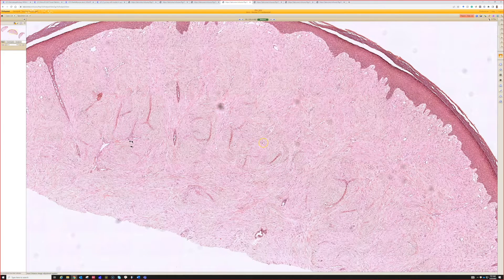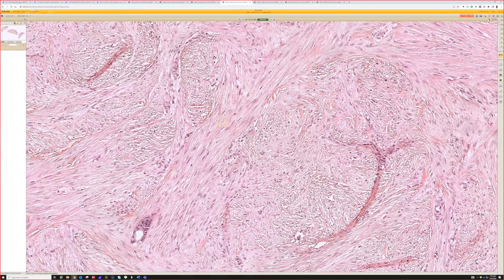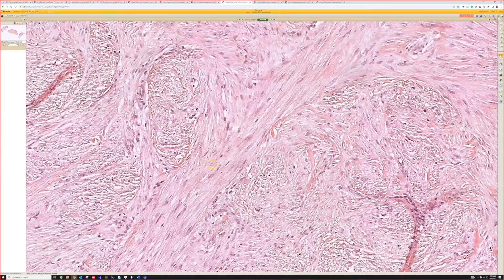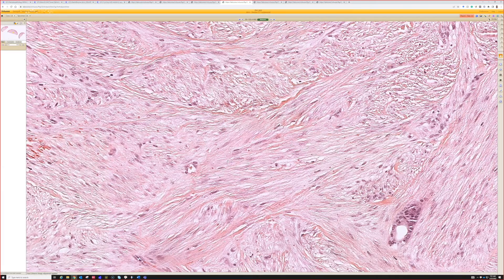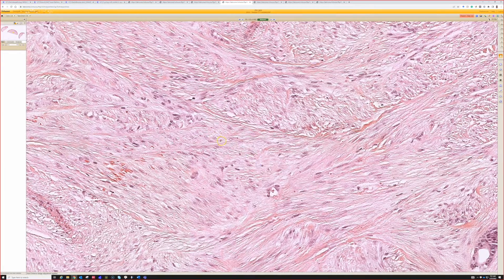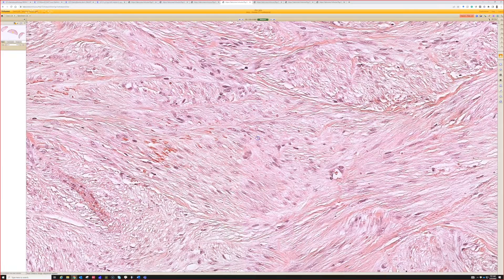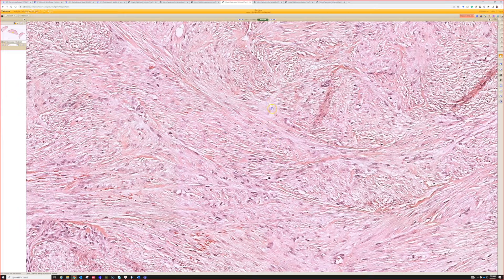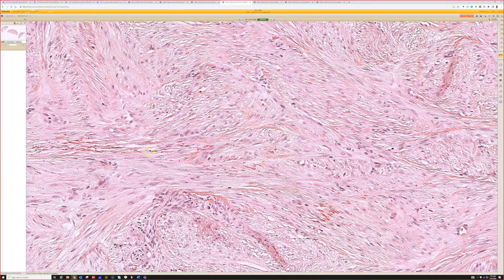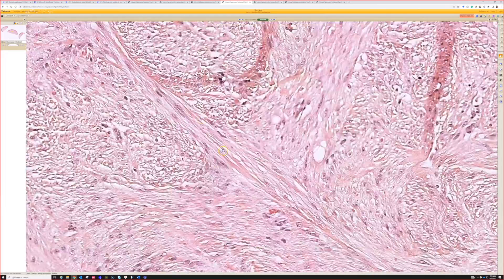It can sometimes extend down into the subcutis but usually fills up the dermis, with somewhat intersecting fascicles of bland fibroblasts or myofibroblasts. On close look, you see those little pink balls — tangled actin fibers — which are the so-called inclusion bodies. Various stains have been proposed to highlight these, but on H&E they usually stand out nicely. Once you know to look for them, you see they're everywhere — little pink dots in all the cells all over the place.